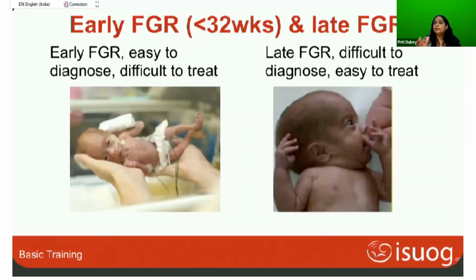When you see that there is altered CPR, that is cerebroplacental ratio, you will know that these are the late FGR babies, and these are the babies which are going to land up in stillbirth. And we don't get the answer. The patient is asking, why, two weeks before you saw my scan, why did my baby die? So you have to be very cautious in doing the ultrasound as well as the Doppler.